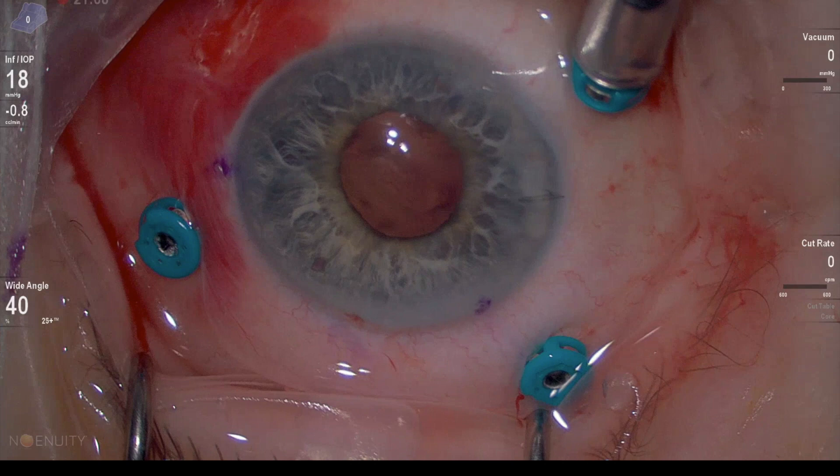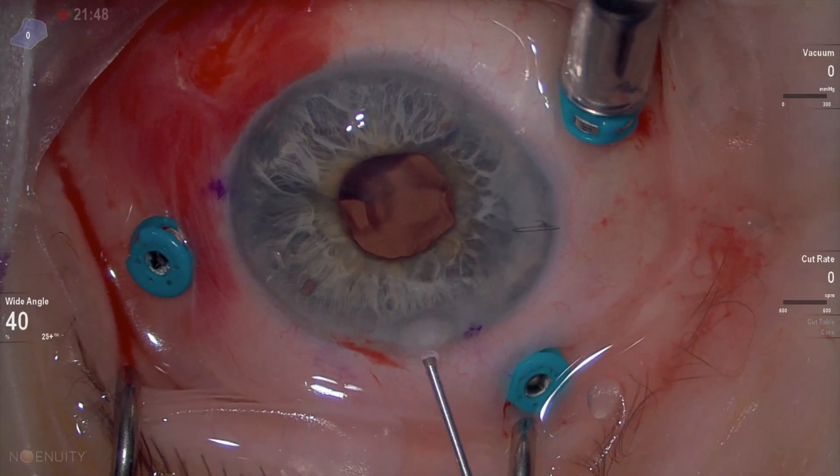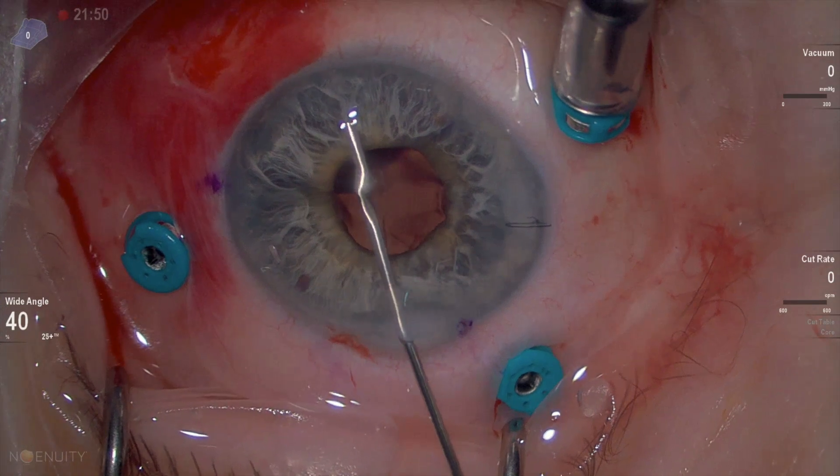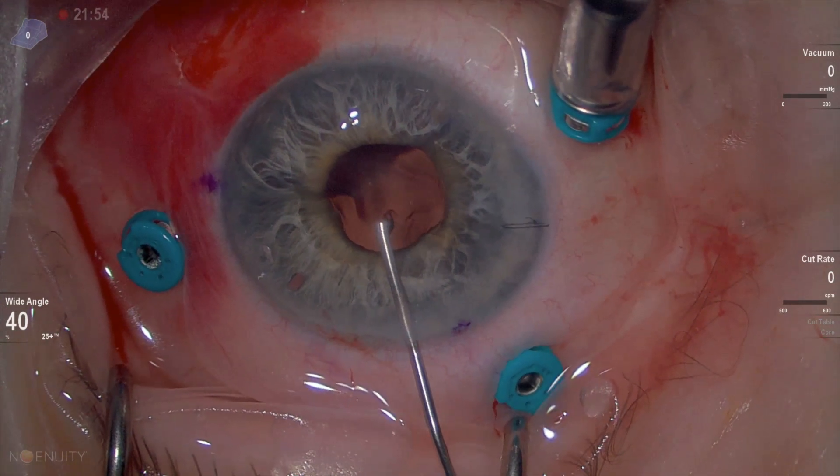It took the resident two attempts to do it, but usually it can be performed in one go. Cohesive viscoelastic is placed in the anterior chamber to push the iris back and form the anterior chamber, and also to protect the cornea.